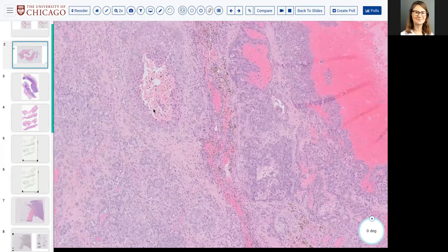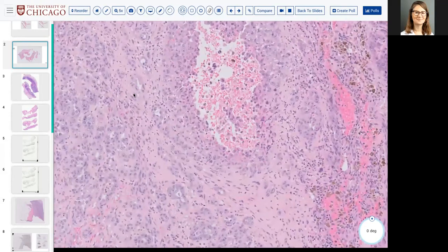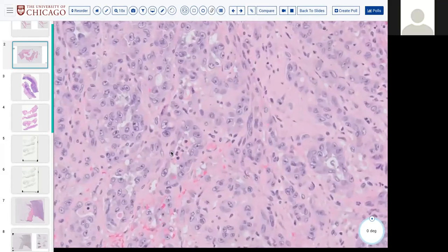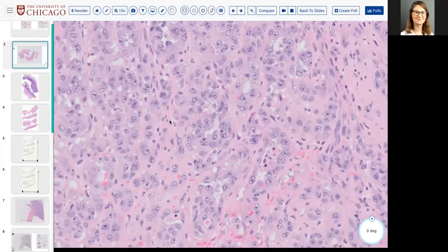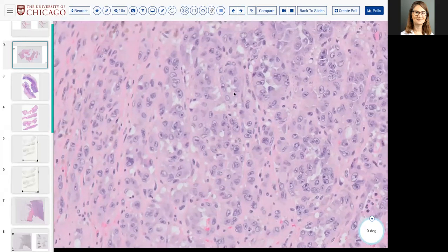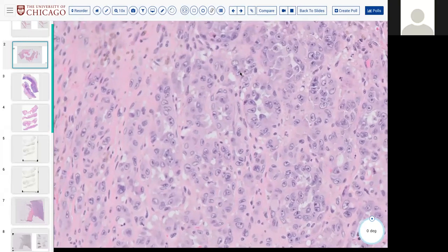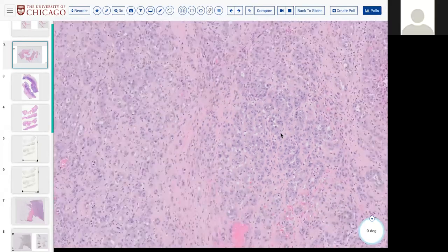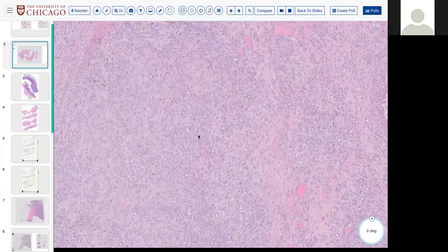Okay. What else? So these cells are also epithelioid. However, they are truly forming or trying to form vascular channels where the channel is surrounded by multiple cells, rather than there just being an intracytoplasmic vacuole. Yeah, multiple layers. The cells are monomorphic, they look alike. What's striking about them, though? Very prominent nucleoli, and very abundant cytoplasm, like an epithelioid appearance.